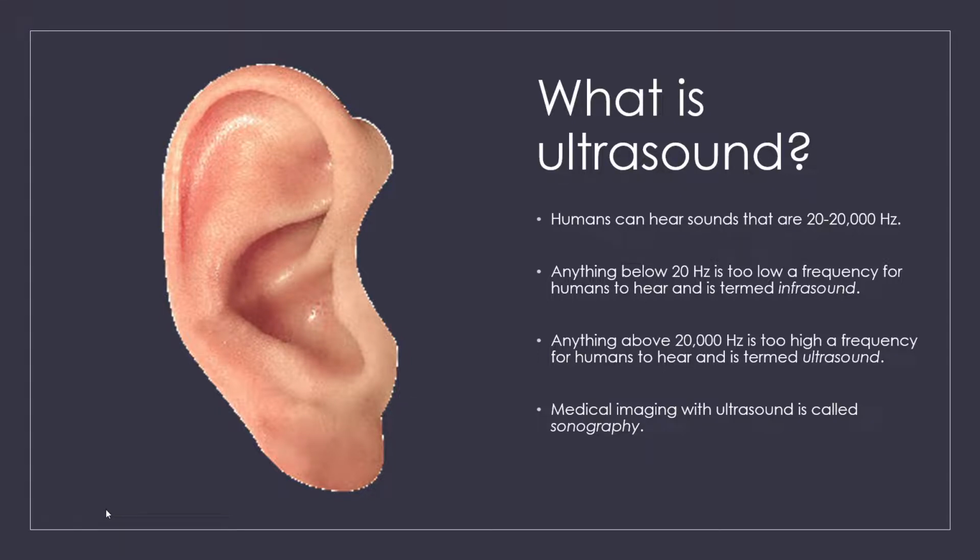But as you'll see later on, we're not able to scan using any frequency that's ultrasound. Medical sonography is performed typically between 2 and 18 megahertz, which is million hertz, okay? Medical imaging with ultrasound is actually called sonography.